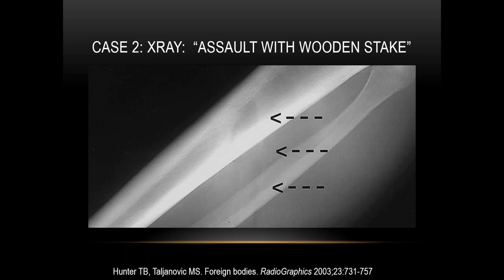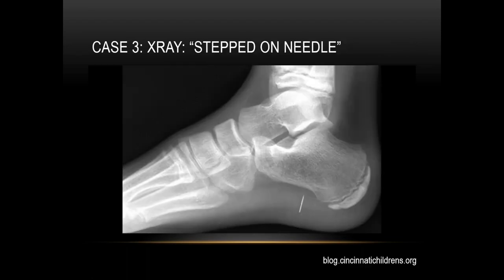In the second case, there was a history of assault with a wooden stake. Again, without arrows pointing to it, it would be difficult to identify this vertically oriented lucency in the soft tissues of the calf. In contrast, this patient who stepped on a needle shows a foreign body that is very readily visible in the plantar soft tissues of the hind foot.